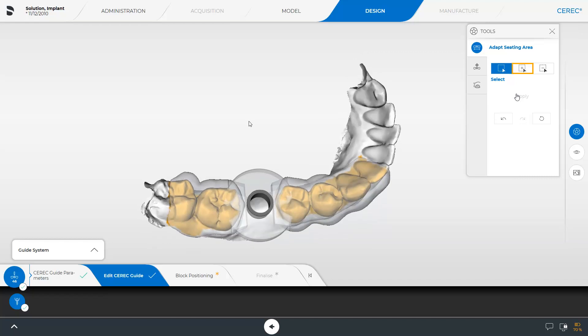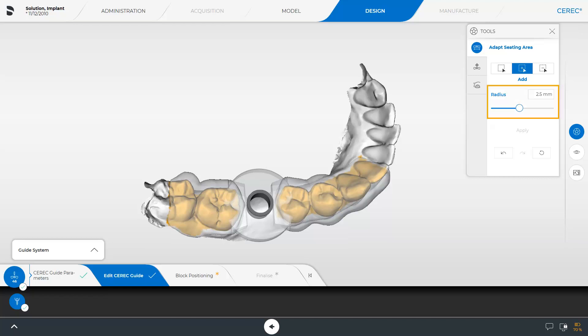We switch to the next option, Add. This tool allows you to add areas in a circular manner. The radius can additionally be adjusted with the slider. For demonstration purposes, we will slightly extend the surgical guide at the distal end.